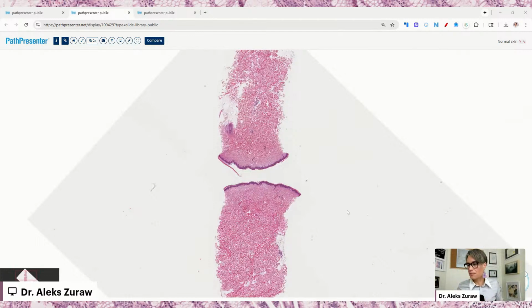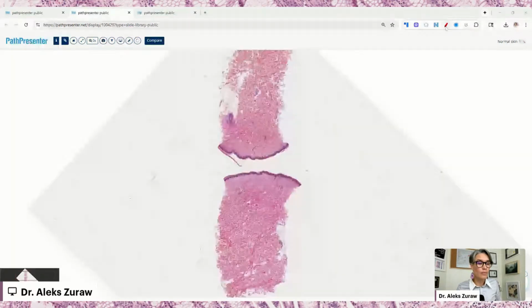And again, we have the big picture. We have 3 layers in the skin. We have the epidermis, dermis, and hypodermis. How can we recognize them from far away? As always, we start from low magnification to high magnification.